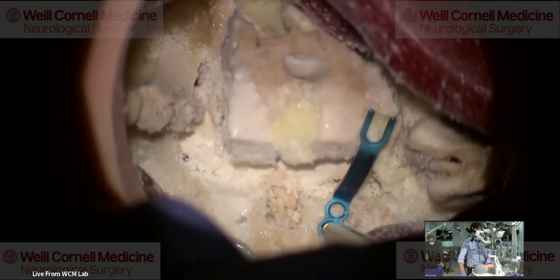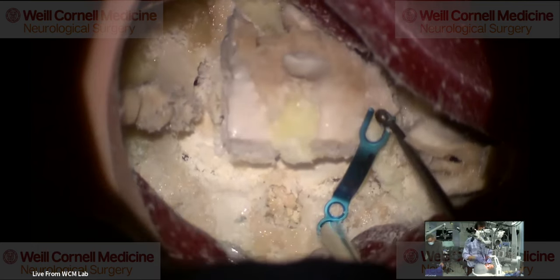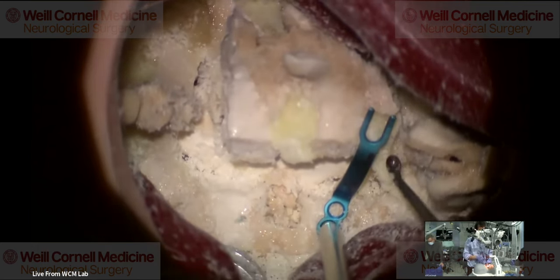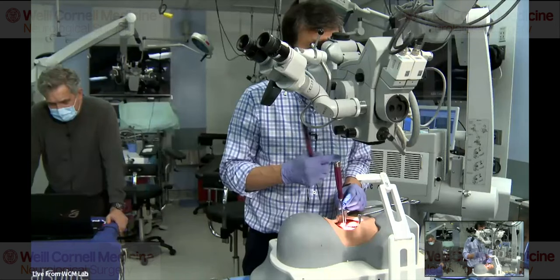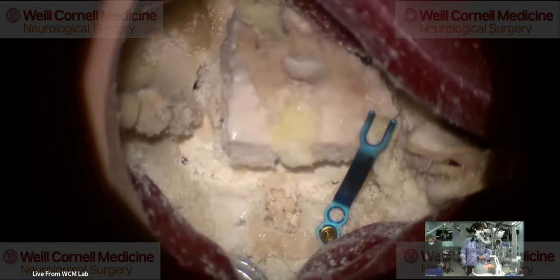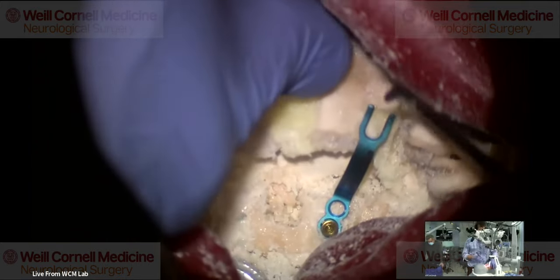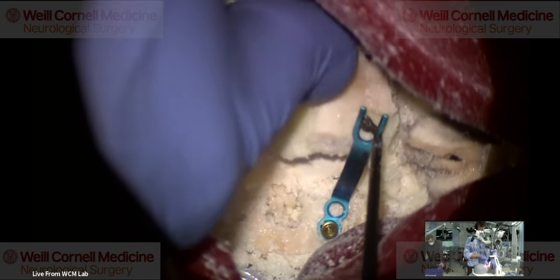This is a tricky part. I have the fellow hold like a Penfield one. Yeah. And try, but it is tricky to really do this. Because it starts to rotate. So what you can do is just put one in, and then you stop, and then put the other one in because that one prevents the rotation. So you don't have to finish one completely.